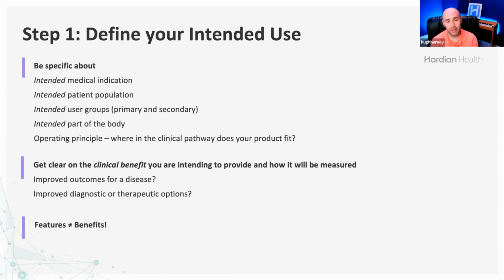But also, where does it fit in the IT infrastructure as well? So are you sitting in a cloud? Are you sitting separate to NHS IT systems? Are you embedded in an EHR? And you have to also align that with all the relevant cybersecurity principles. Again, for a more detailed look at those, you can refer back to our regulatory seminar. So those are the key points of the intended use.